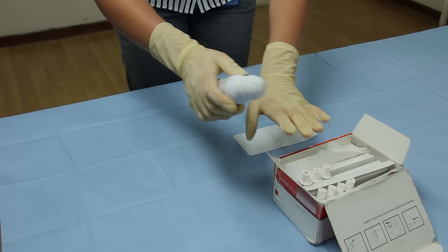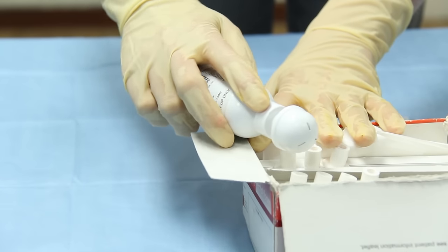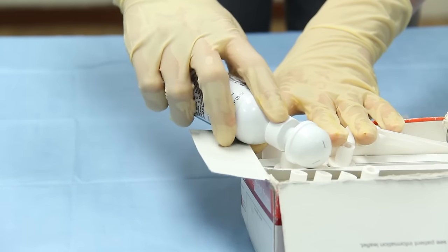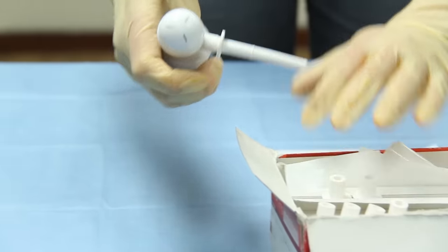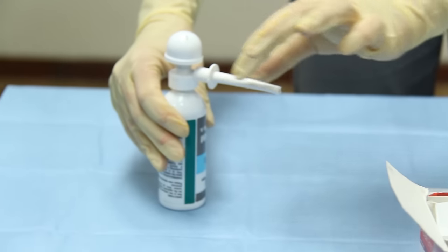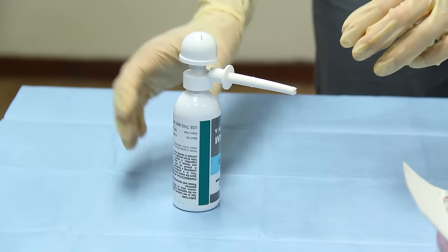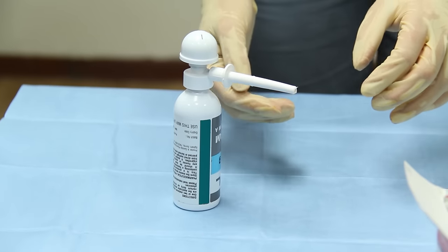So what they need to do is insert the disposable applicator on and pull it out. This applicator contains lubricant on the end so it makes it easier for insertion into the back passage.